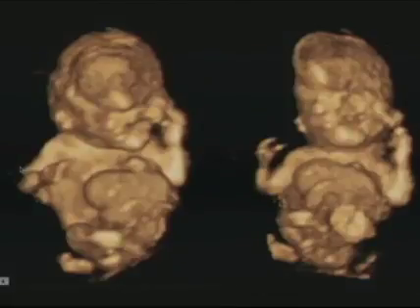But surface rendering shows you the information even better. It actually shows you a severe cleft right in the center of the face right here. And you can see that that cleft is a destructive cleft in that it comes all the way into the middle of the face and goes up into the large encephalocele, or acrania, if you will, where you have a large amount of brain that is not covered by skull. And you can see anteriorly also the very large anterior abdominal wall defect in this fetus with severe amniotic band syndrome.